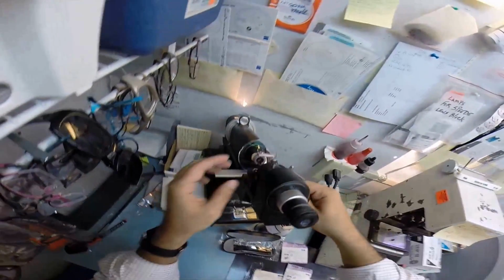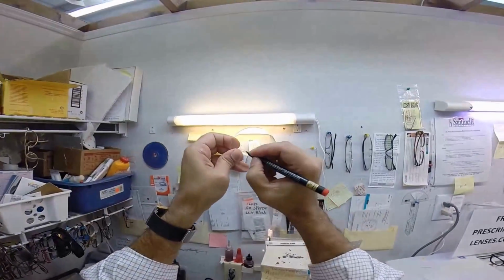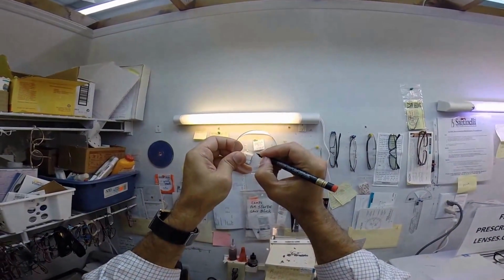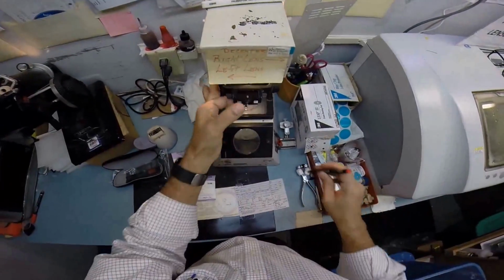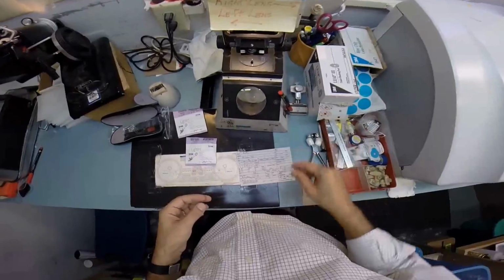And now I'm going to put 3 dots on your lenses, which are probably too light for you to see, so I'm going to darken them. That is 1, 2, and 3. And this is the right lens. I'm going to put that onto my blocker, my speedy blocker.